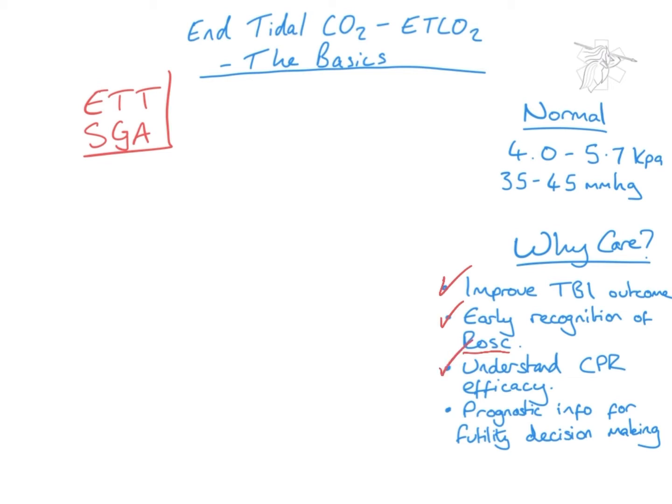And on a sadder note, it also serves as a prognostic tool to help us make futility decisions when managing a cardiac arrest. So we've had a consistently low end-tidal CO2 for the duration of the arrest, and that suggests, obviously combined with other factors, that we're probably getting to the point now where we need to recognise life extinct. So it's a really useful tool, and if managed correctly, can improve outcomes for our patients.